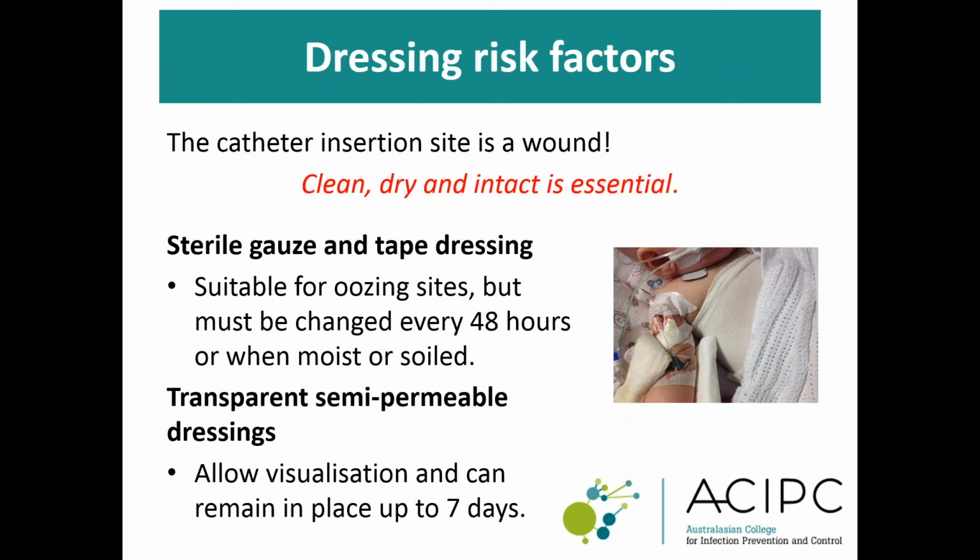Transparent semi-permeable dressings can remain in place up to 7 days. These have evolved over time to offer greater vapor permeability, which increases the rate of evaporation of fluid from the insertion site, keeping the site dry and reducing the risk of infection. And these also allow for visual inspection of the insertion site, making it easier to identify early signs of infection.